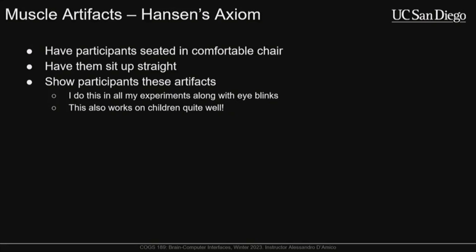And then again, Hansen's axiom: have participants seated in a comfortable chair to reduce muscle artifacts and back artifacts, have them sit up straight, and then show participants the artifacts just like I was explaining.